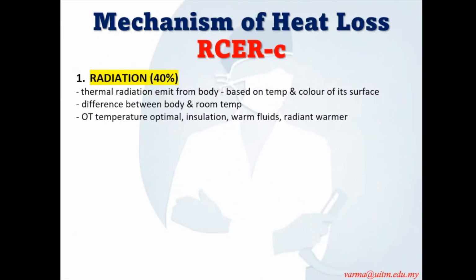That is why we make sure when the patient comes in, before making the skin incision, when you induce, you don't have to make the OT temperature very cold. You can maintain it at a bit higher temperature. Once you induce, and they're being painted and draped, before they start the incision, then you can bring down the OT temperature. That is one of the suggestions given in the NICE guideline to prevent perioperative hypothermia.